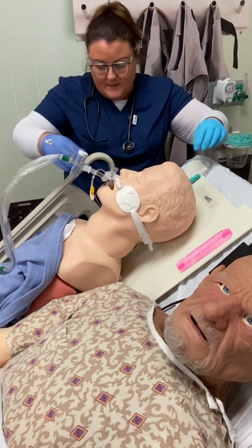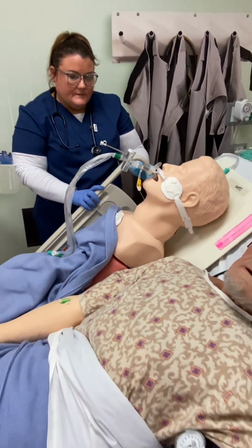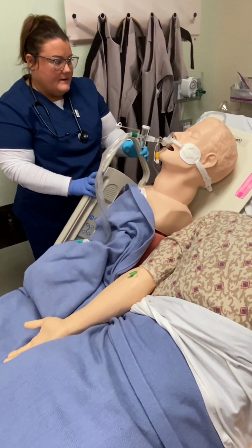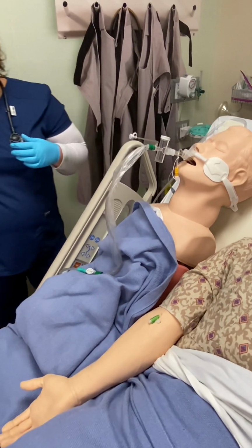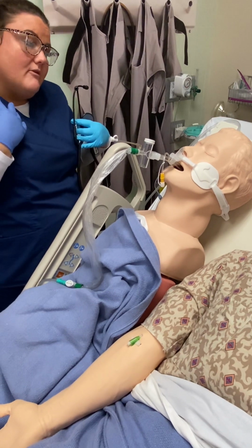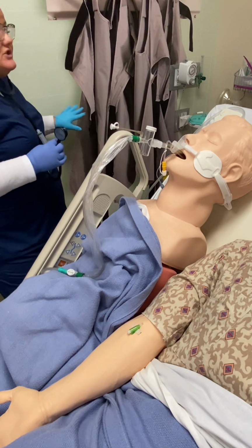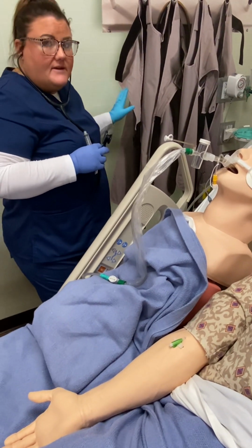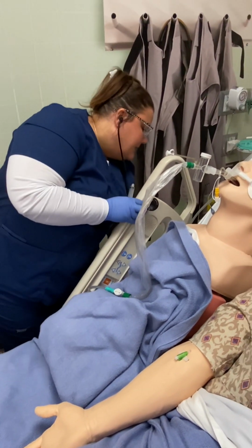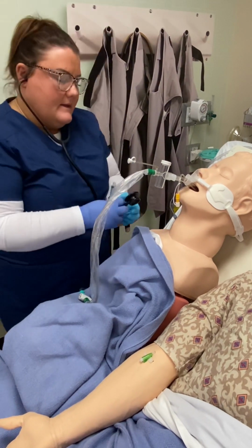All right, Mr. Smith. Just gonna sit you up a little bit. Okay. I'm just going to deflate your cuff and I'm gonna listen to the air around it, okay? So I would check my vent one more time, make sure that he's still hyperoxygenated. If he needed it again, I would go ahead and hit the O2 boost. Like this better out here. Okay. All right.